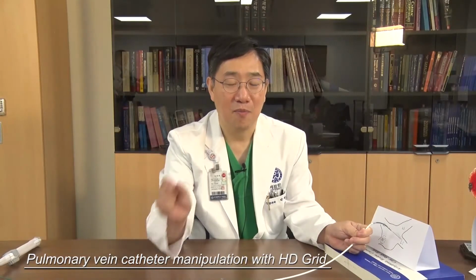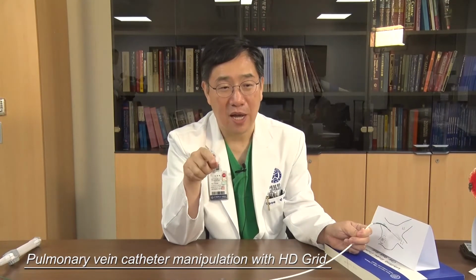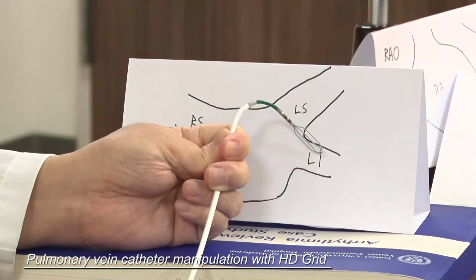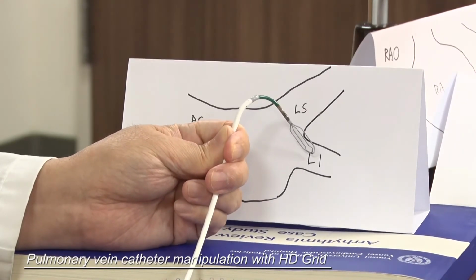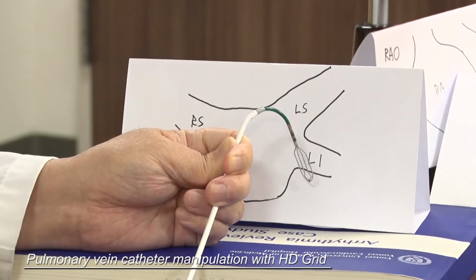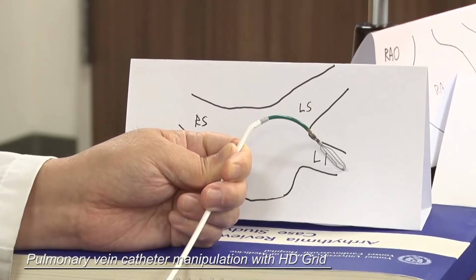But sometimes, if the pulmonary vein is very flat and has a narrow diameter, it is hard to push the grid catheter inside. In that case, make a big curve like this, apply clockwise torque directed posterior, and push. If the tip of your grid catheter is just inside the left inferior pulmonary vein ostium, you can keep the same position of the sheath, push the catheter slowly and open the curve. Push the catheter and open the curve, and you can get the left inferior pulmonary vein.